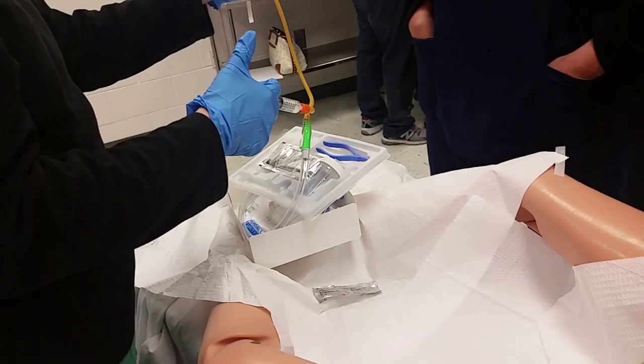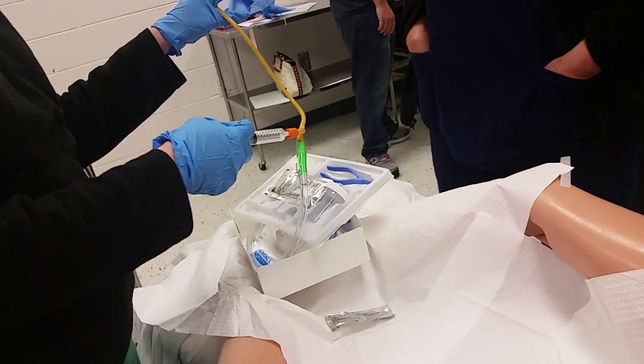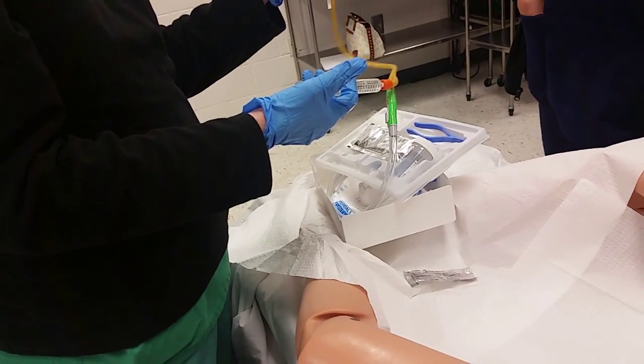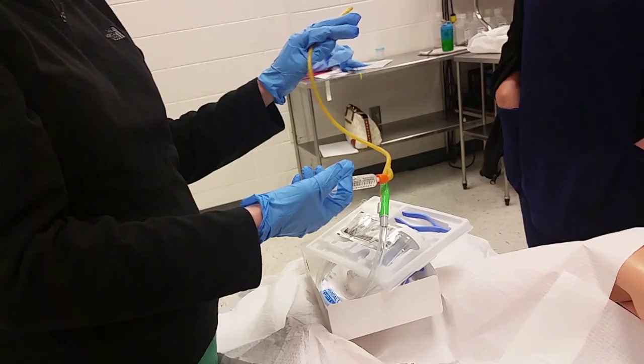You just want to test it to make sure that there's no holes. Obviously you're not putting all 10 cc's in there — you're just blowing it up enough to make sure that when you do it for real and leave it in their bladder, it's not going to burst. And then the water didn't leak out.